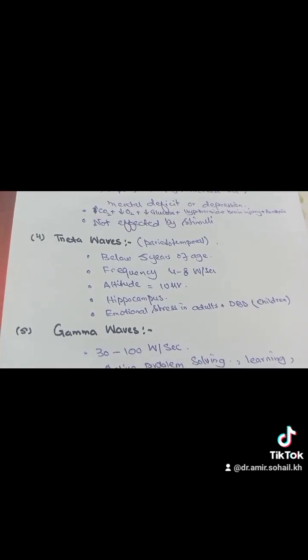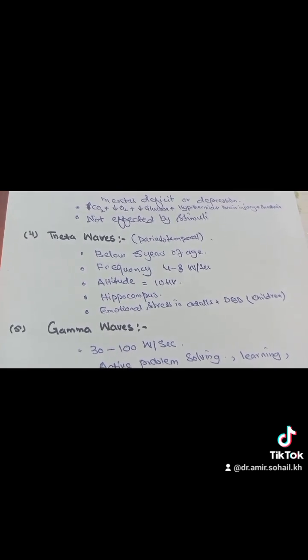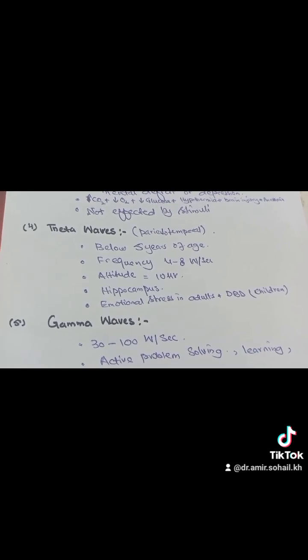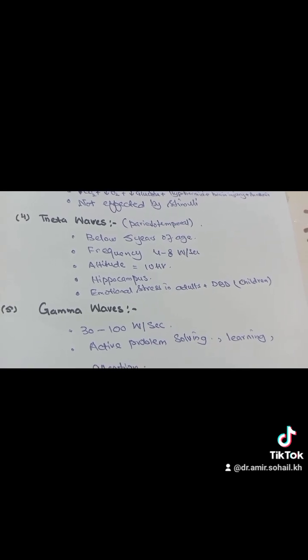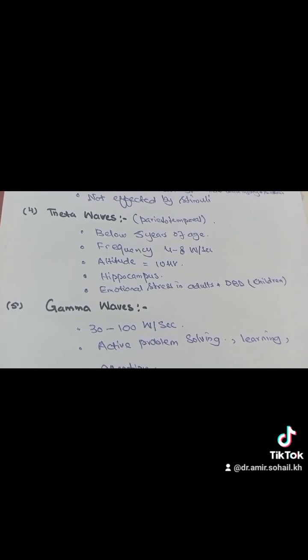Theta waves are obtained from the parietotemporal area of the brain. These are seen below 5 years of age. Frequency is between 4 to 8 waves per second. Amplitude is 10 microvolts. These are basically obtained from the hippocampus and are seen in emotional stress in adults. They are also seen in children and degenerative brain disorders.